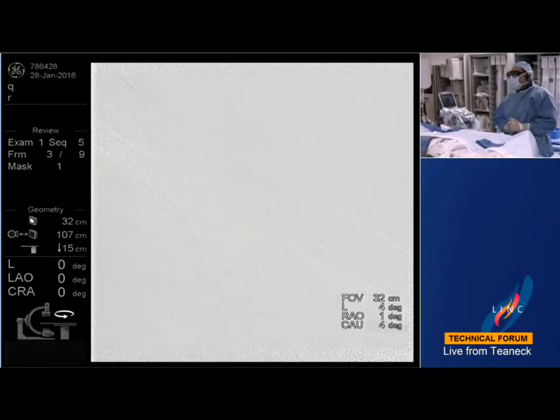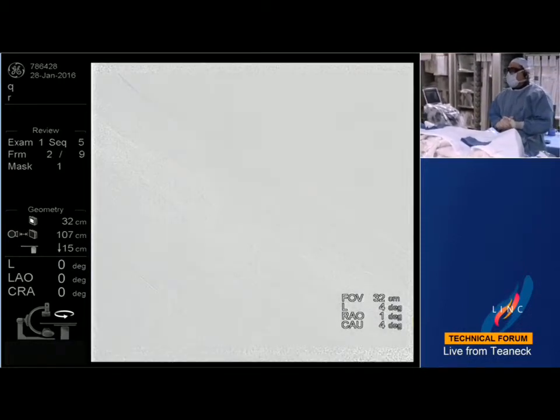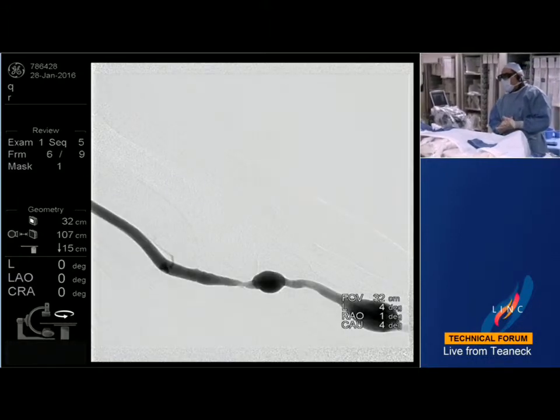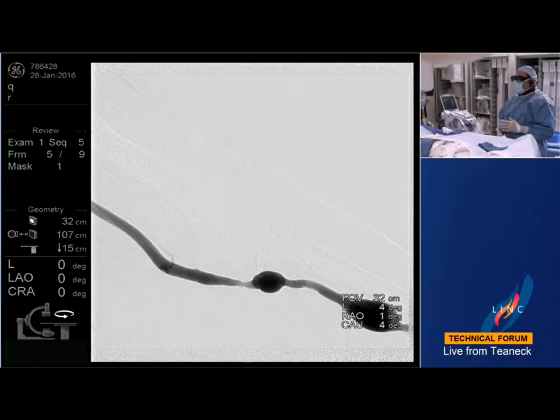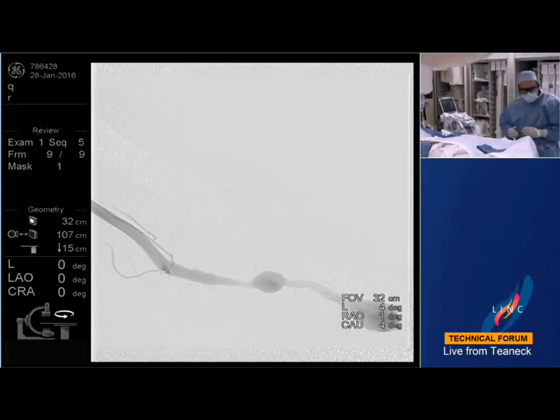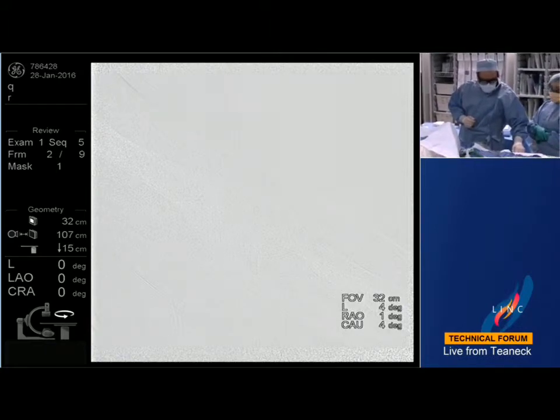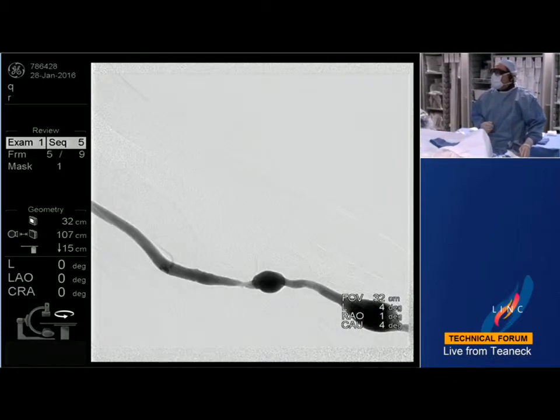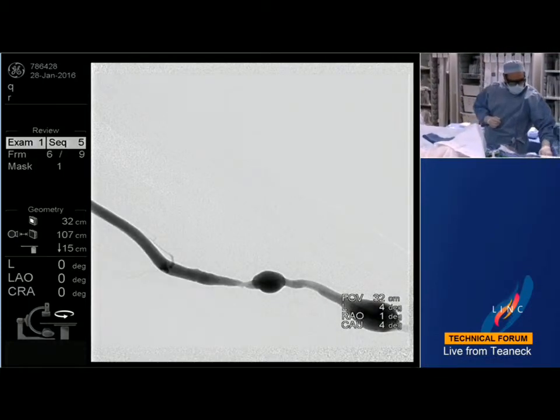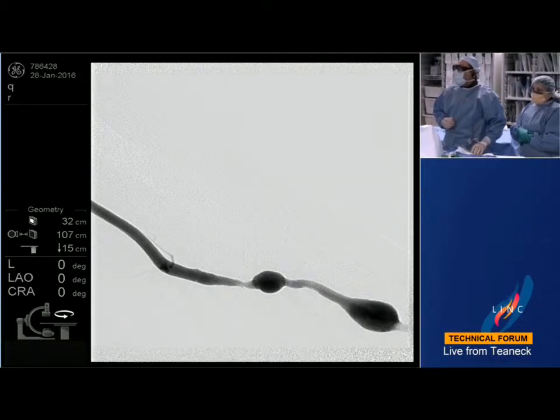Right. In this case, the second set of images are essentially up the arm, about the antecubital fossa, an area we usually consider to be stenotic, and that's an area that we're likely going to treat. But then as I kept going up the arm, and that's where we are right now, I'm going to take a better look. Let me just take this out for a second, then I'm going to put it right back. Just give me 1 second while we try to get the more central shot, and that's what I'm about to do now.